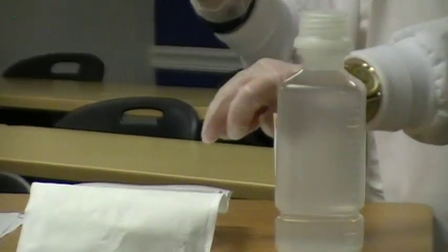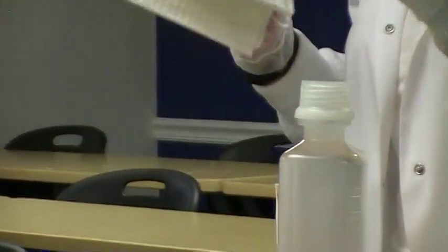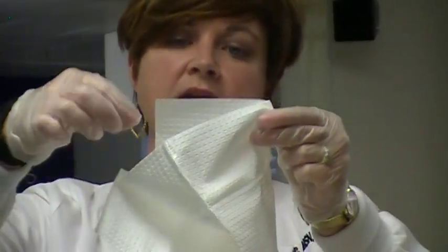So again, your feet are not set in concrete. You want to move around the table so that you're not contaminating any part of your sterile field. So I'm going to move around here to the side. I'm going to grab my drape, pull it up, out. Then when you're using your sterile drape, you just let it fall out.